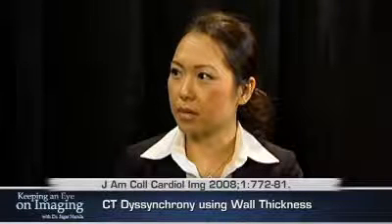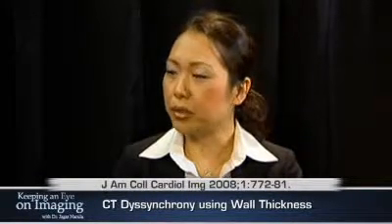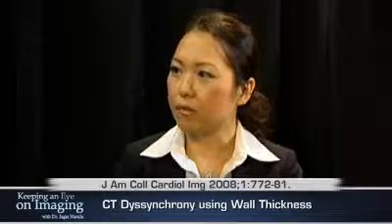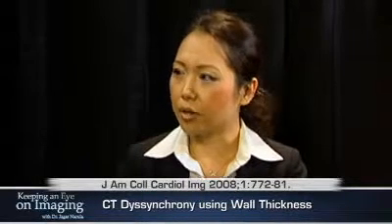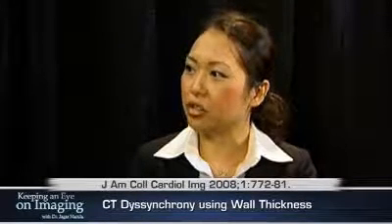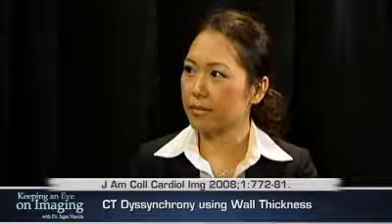So how many patients did you include in your study? So we evaluated 38 patients, and we took 3 groups of patients who had undergone 64-slice CT for coronary artery assessments. We classified them as either heart failure wide QRS patients, heart failure narrow QRS patients, and age and gender matched normal controls. And what did you find when you looked at these patients?